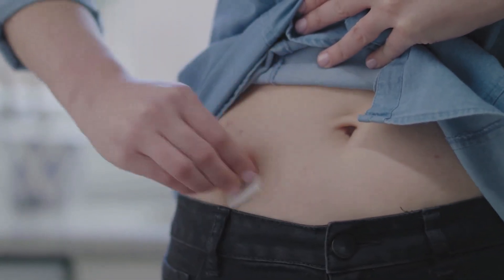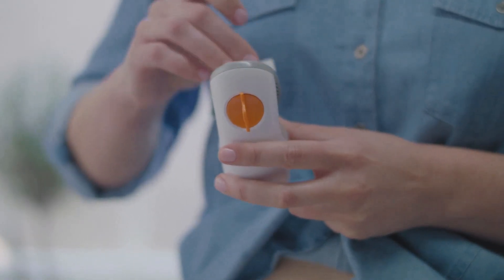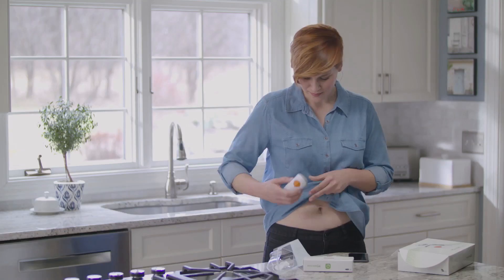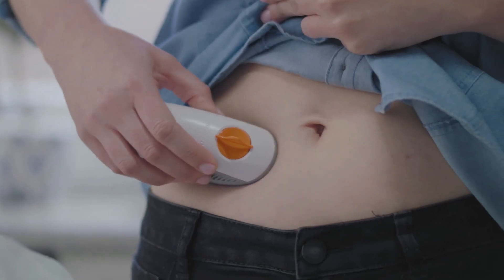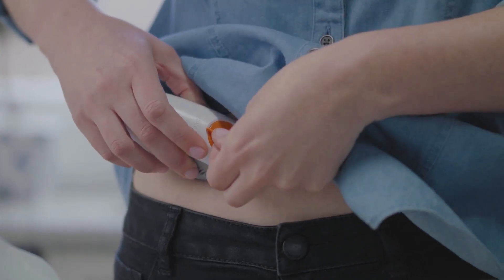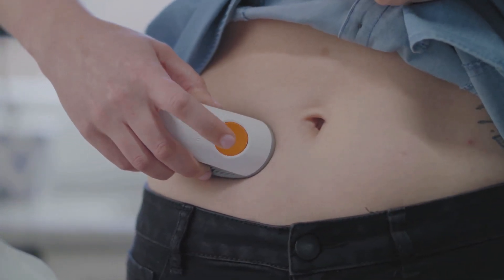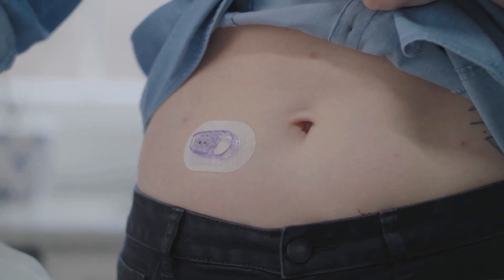Clean your skin with rubbing alcohol and let it dry. Grab the sensor you used during setup and remove both labels. Do not touch the adhesive. Place the applicator on skin. Remove the safety guard — fold and break it off. Press the button to insert the sensor. Remove the applicator. You've successfully inserted your sensor.